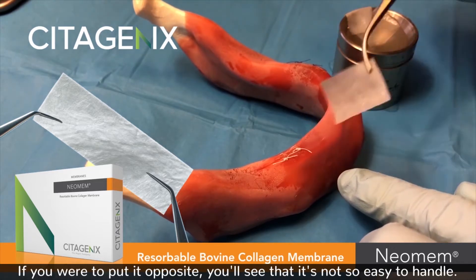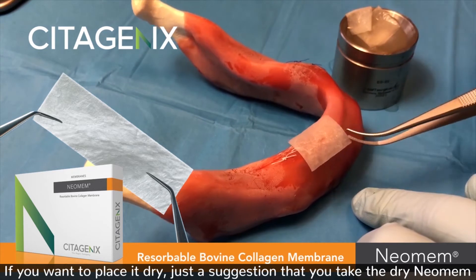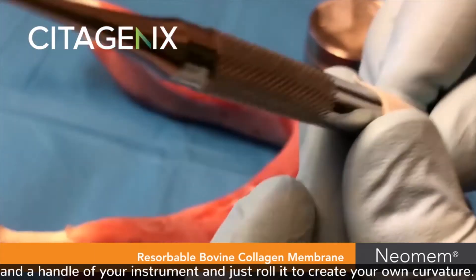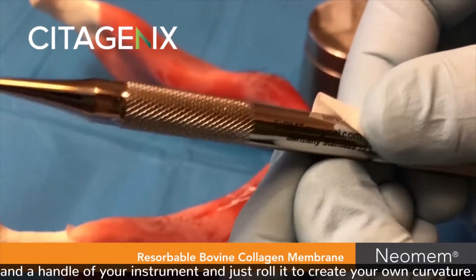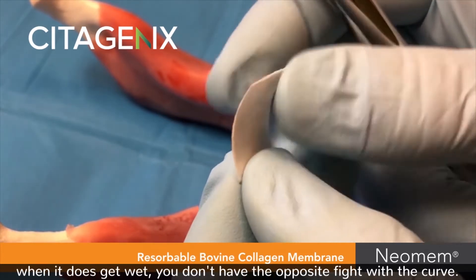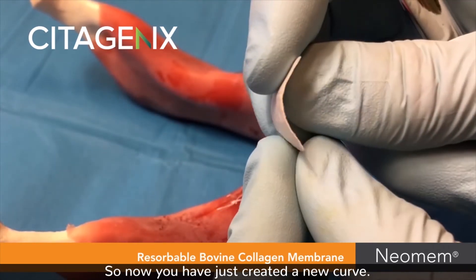If you put it opposite, you'll see it's not so easy to handle, so just something to note. If you want to place it dry, a suggestion is to take the dry Neomem and a handle of your instrument and just roll it to create your own curvature, so when you want to tuck it into your lingual or palatal area and it gets wet, you don't have the opposite fight with the curve. So now you have just created a new curve.